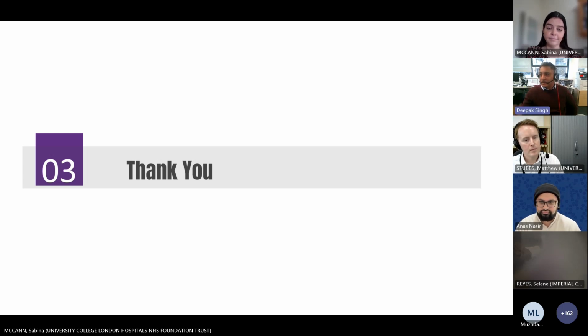Oh, I can take that. I think this is the one that we talked about with the chemiluminescence methods being falsely low in query sepsis type conditions. Now, often the manufacturer is aware of it, and they're working on a solution to fix it. It is complicated, but in these circumstances, the FRET method or an alternative method is the only solution for this scenario.